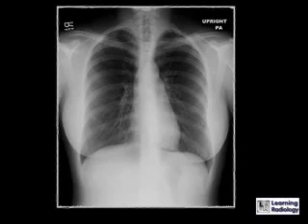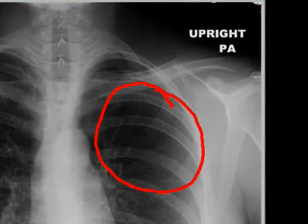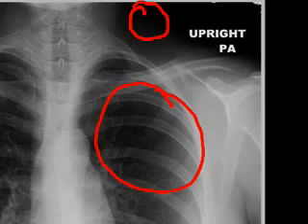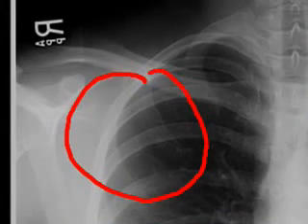How this works in everyday practice is shown on this frontal chest radiograph. We can see air density here in the left upper lobe of the lung. You can also see air density in the room surrounding the patient. We can see fat density in the chest wall. We can see fluid or soft tissue density in the right upper quadrant of the abdomen with the liver. We see bone or calcium density in the clavicle, scapula, and ribs.